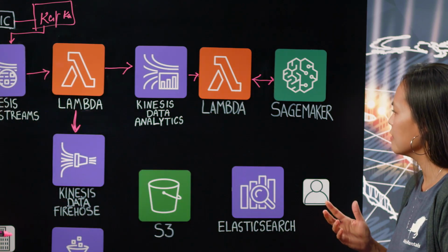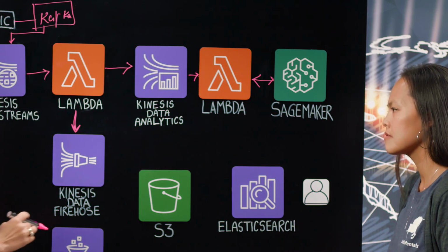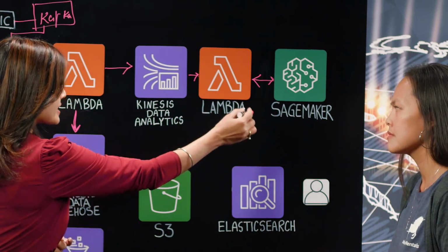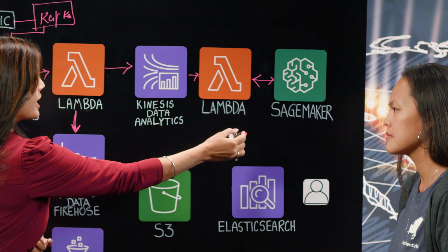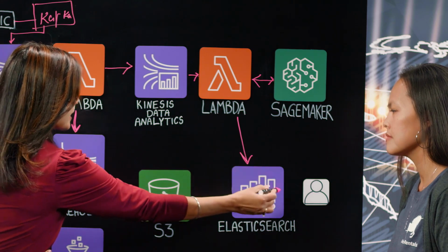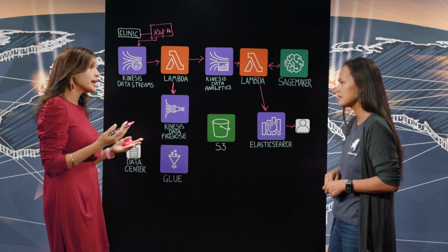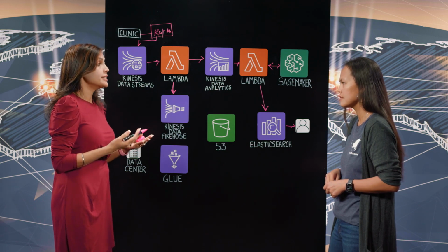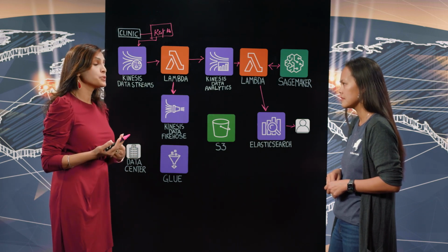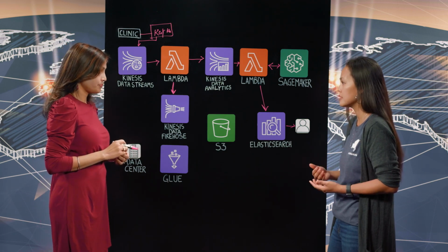So from that predictive modeling, who visualizes that? So the SageMaker inference results here are then sent back to Elasticsearch, where we are building visualization through Kibana for our user groups who can look at a patient's probability whether the patient is about to go into intradialytic hypotension. So they're able to visualize that near real time.